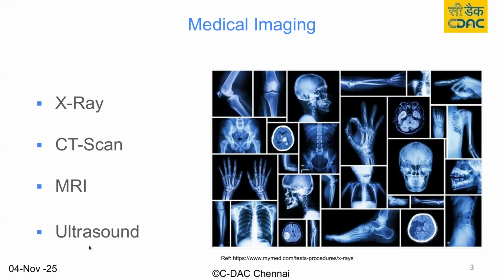Another type of imaging technique is ultrasound imaging. Based on sound wave reflections, the images are generated. So these are the different kinds of images that you commonly see in the medical world.